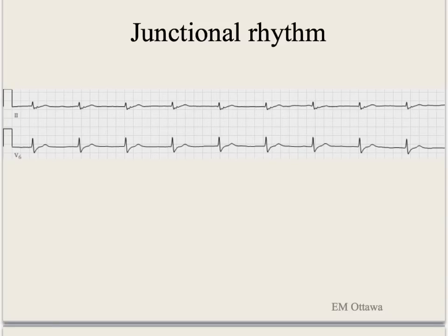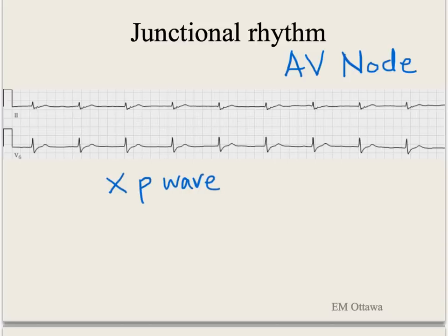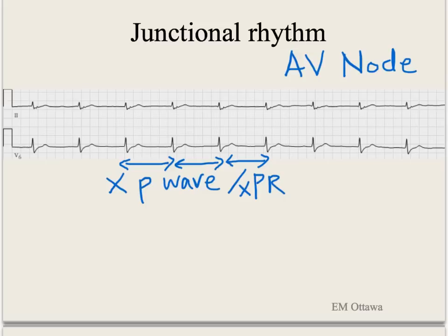This next rhythm is a junctional rhythm. Junctional rhythm originates in the AV node. Because of that, there will be no P wave, and hence you cannot look at a PR interval. Since there are no P waves, there is also no relationship between the P wave and the QRS complex. The RR intervals look regular, and for junctional rhythm the rate should be between 45 to 60. The QRS complex is narrow.